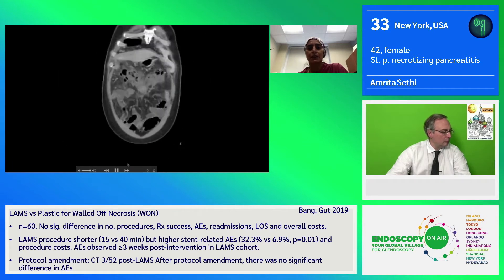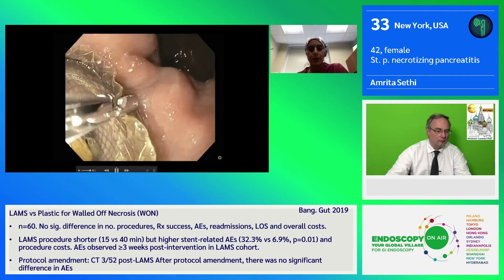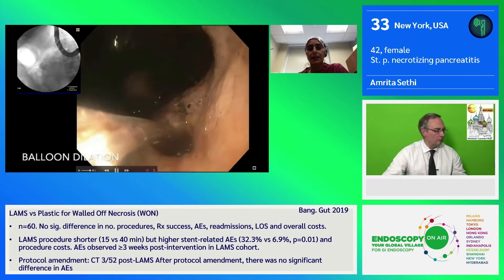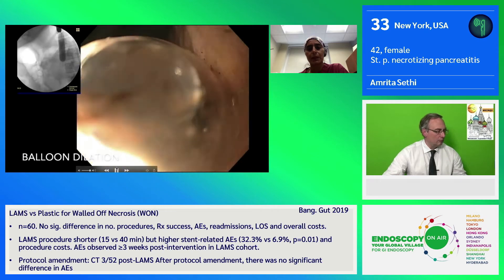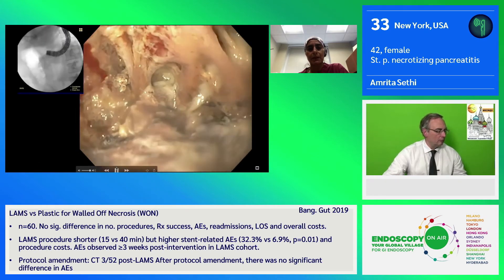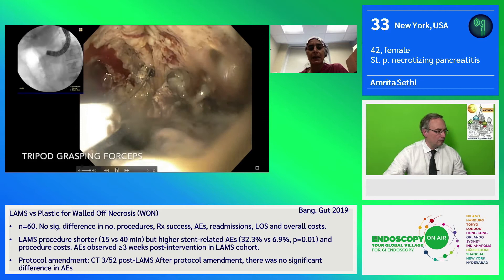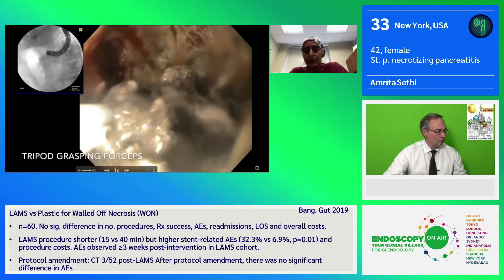Follow-up CT shows some resolution but ongoing necrosis. When we brought him back for the next session, we removed the AXIOS stent in order to help us access the collection and maneuver better. We also dilated the tract with a CRE balloon, 15 to 18-millimeter, in order to allow better intubation with a therapeutic channel scope. Here you see the collection with a significant amount of debris, and we begin necrosectomy using various different instruments.